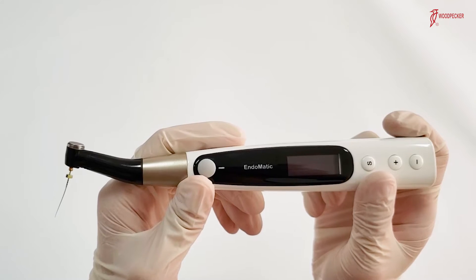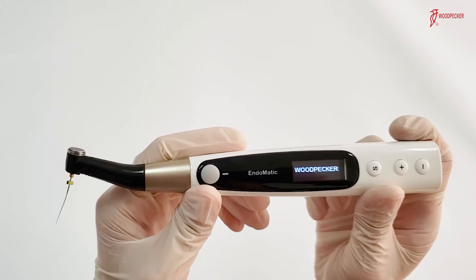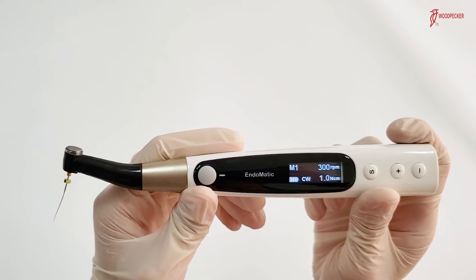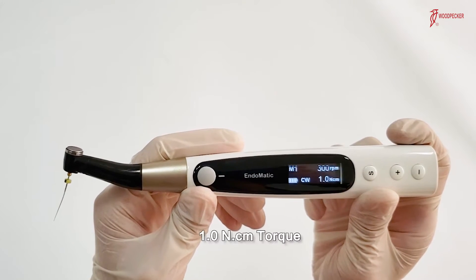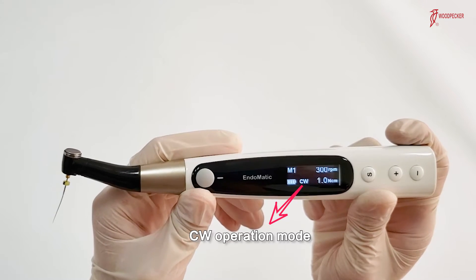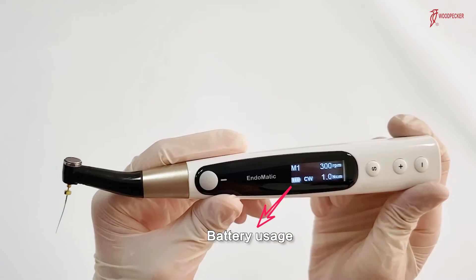For EndoMatic, press the power button to start up the device. Please look at the screen — there are 5 display parameters. M1 stands for program. 300 rpm stands for speed. 1.0 Ncm stands for torque. CW stands for operation mode. And this icon shows the battery usage.